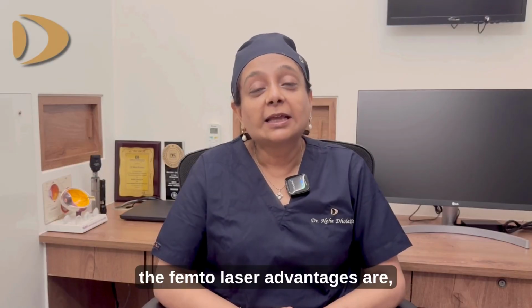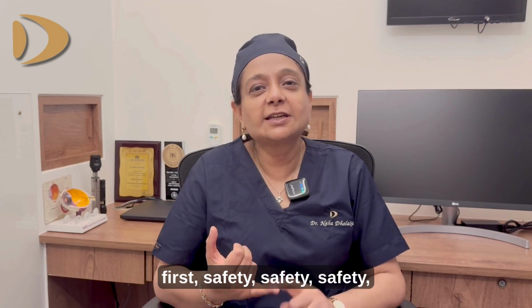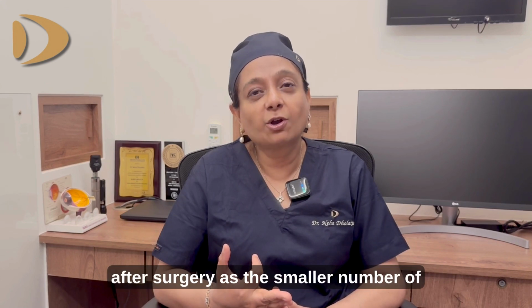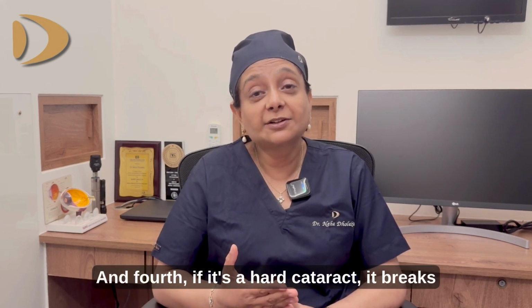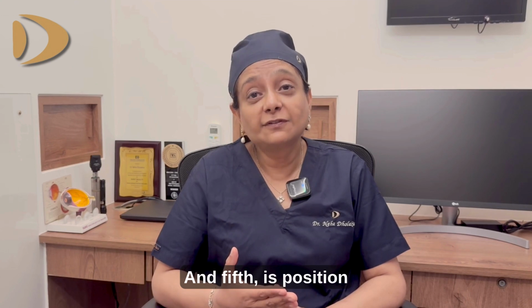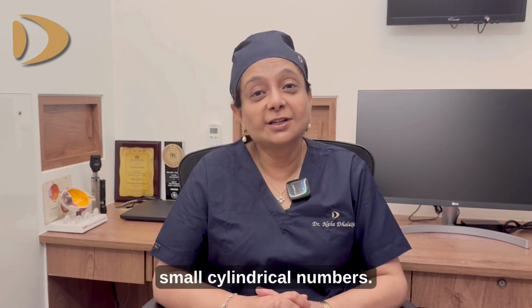So in short, the femto laser advantages are: first, safety, much more precision; second, better sharpness of vision after surgery as the smaller number of cylinder is removed. And fourth, if it's a hard cataract, it breaks the cataract into smaller pieces, thereby giving less heat generation. And fifth is positioning of the cylindrical lens or eliminating small cylindrical numbers.